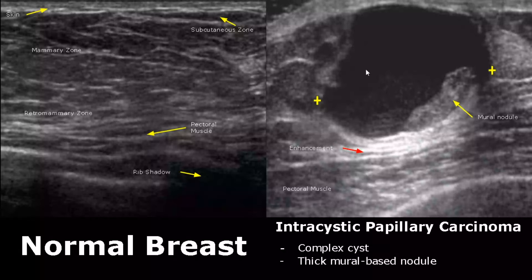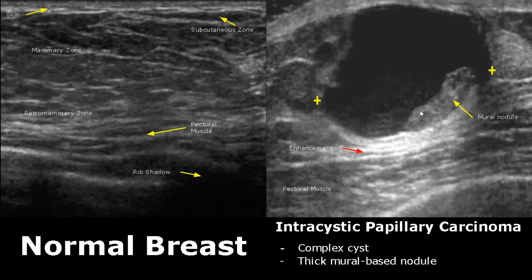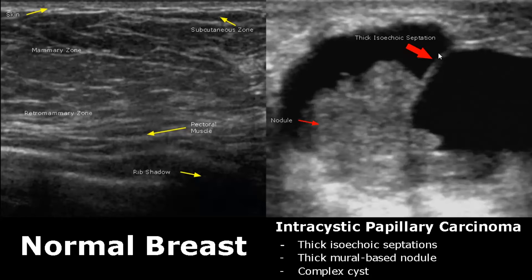Intracystic papillary carcinoma consists of a complex cyst with a thick mural-based nodule. This nodule will be attached to the wall and will not move around. Here we have another image of intracystic papillary carcinoma.